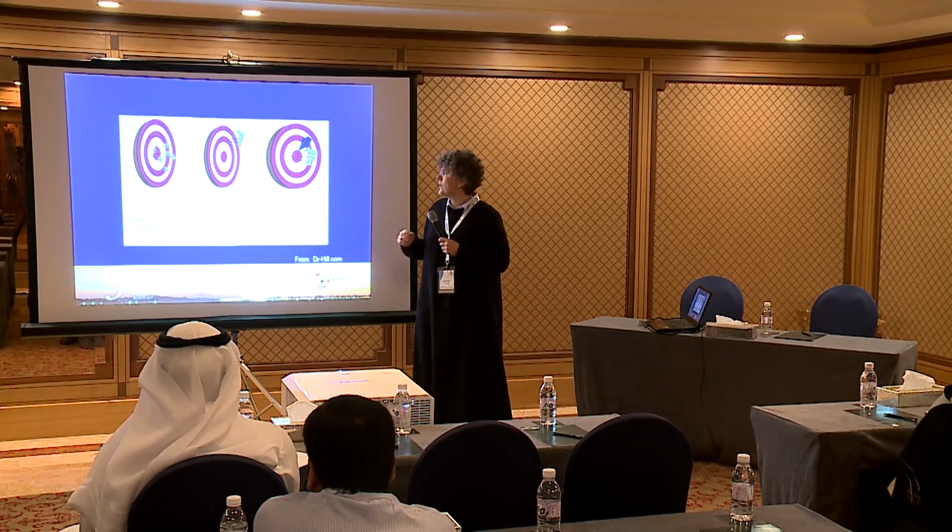So what did ultrasound biometry and optical biometry do for us? This is what we do with the ultrasound biometry. We shoot and we hope to get into the center of the target again and again. But we have a scatter because of the different problems. The IOL Master and the Lenstar, what they did is we get very accurate biometry. We get very accurate results, but we may be a little bit off target. And every time a little bit off to the same side.